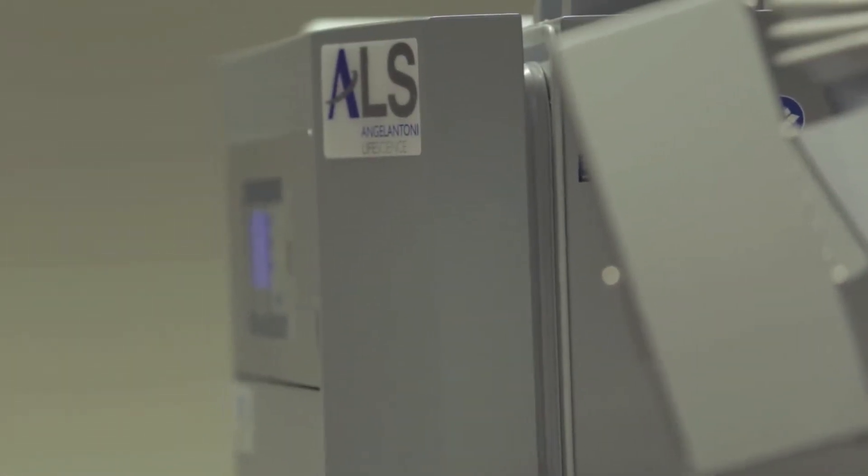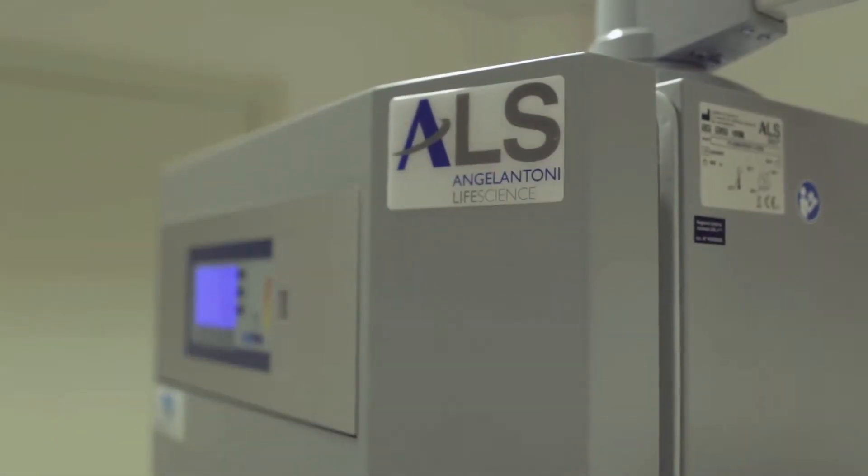We now turn to a practical demonstration of the operation. From start-up, Plasma Frost Item requires less than 60 minutes to reach operating temperature.